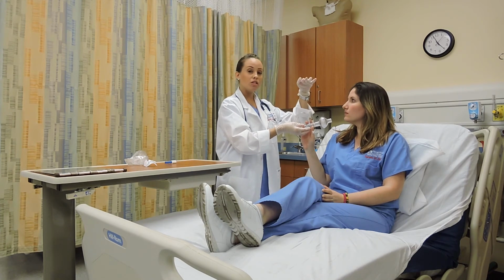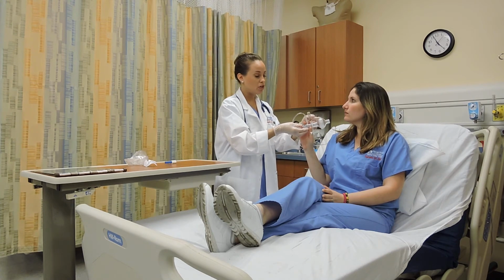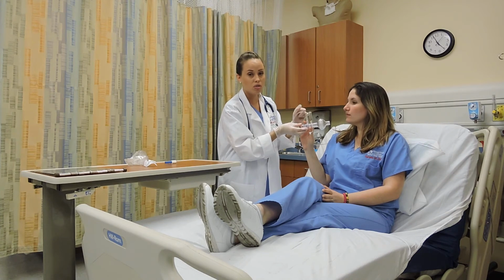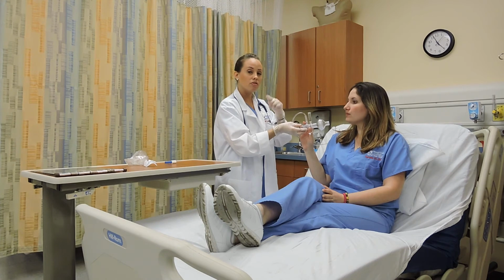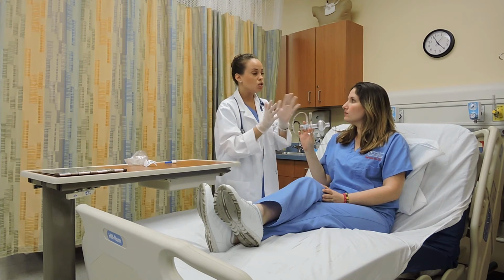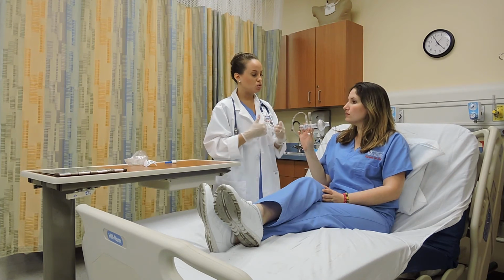Then at the end of inspiration, you're gonna exhale through the one-way valve, and you're gonna try to achieve an airway pressure of 10 to 20 centimeters of water. You're gonna try to make exhalation last 3 times longer than inhalation. And you're gonna do 10 to 20 breaths, followed by 2 to 3 huff coughs to clear those loosened secretions.